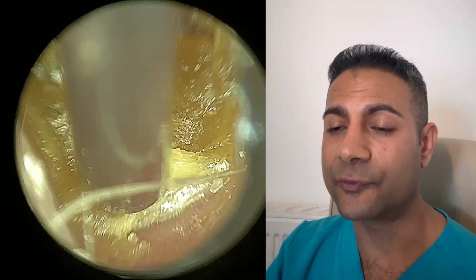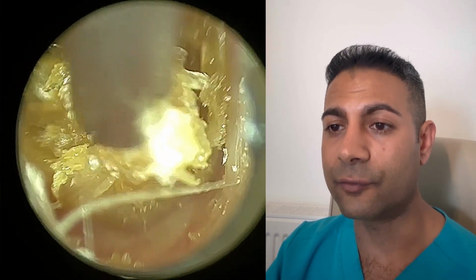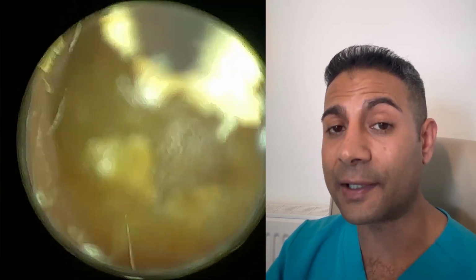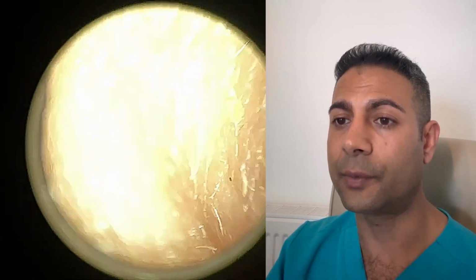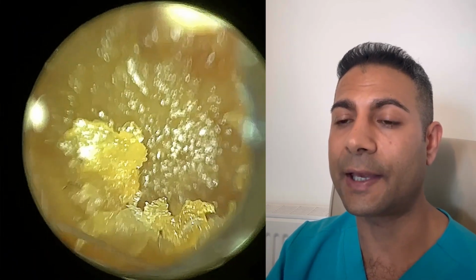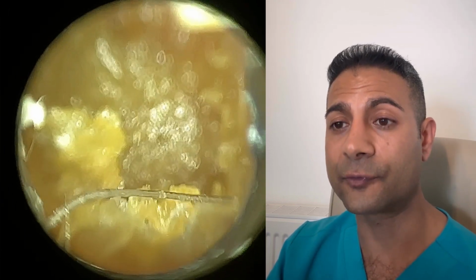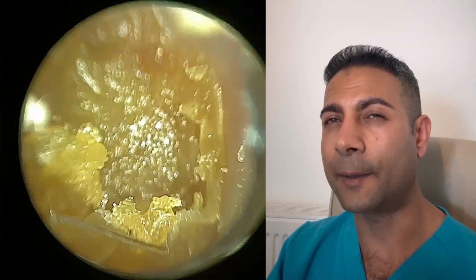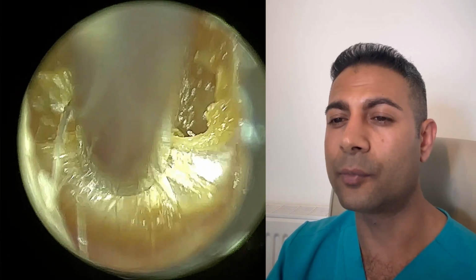And as you can see, we're working very close to this patient's canal walls. And for that reason, I'm using the fine end suction probe. So the Zollner suction probe, which is the normal suction probe that we use to perform microsuction, has an outer diameter of around 2 or 2.1 millimeters. Whereas with the fine end, I'm using a 17 gauge fine end, so it's about 1.4, 1.5.